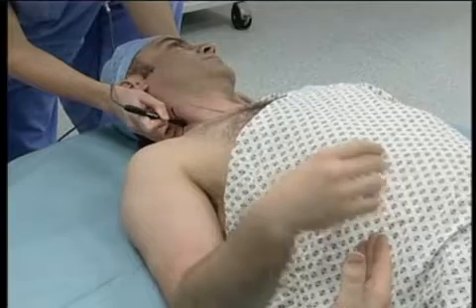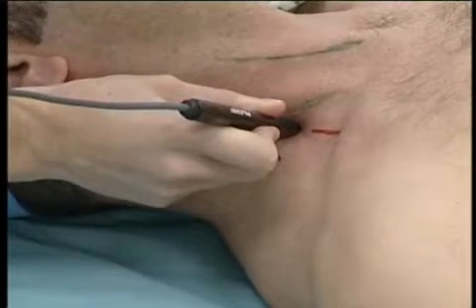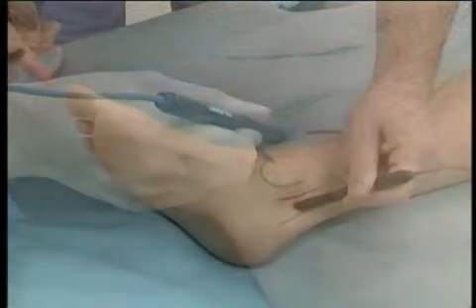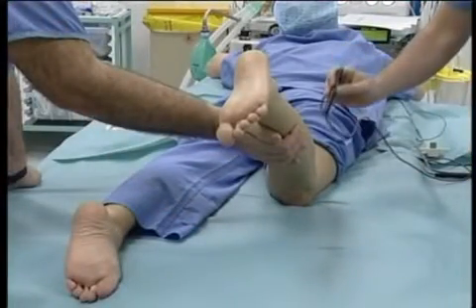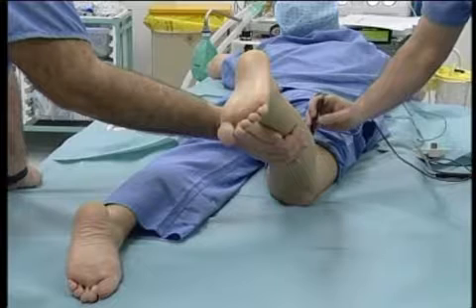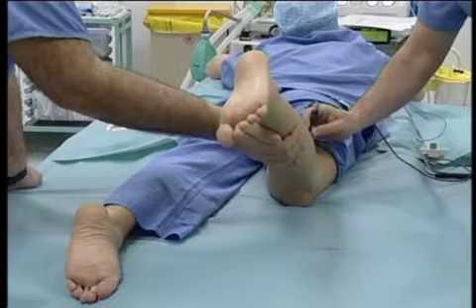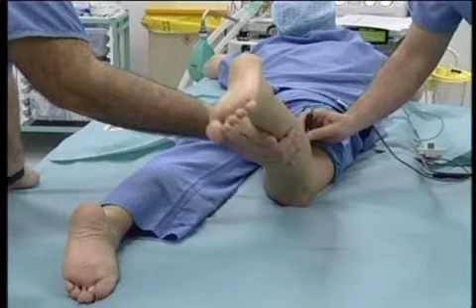The technique allows the awake subject to experience paresthesia and motor twitch in a controlled environment. Hence the patient is aware what they will experience and is often less fearful of nerve blockade. Aside from patient benefits, it provides a teaching tool to anaesthetists. Anatomical landmarks are an essential prerequisite. However, rapidity, control and fluency of performance can gain patient confidence. The latter can be learnt by practicing with the PAJUNK sensor nerve stimulator and PEG in teaching sessions.